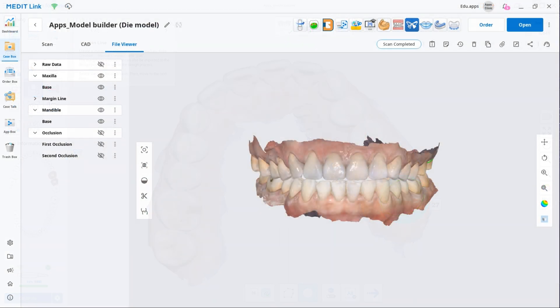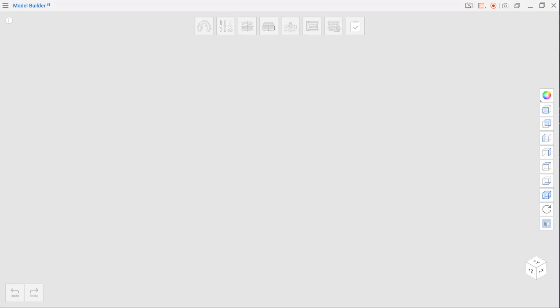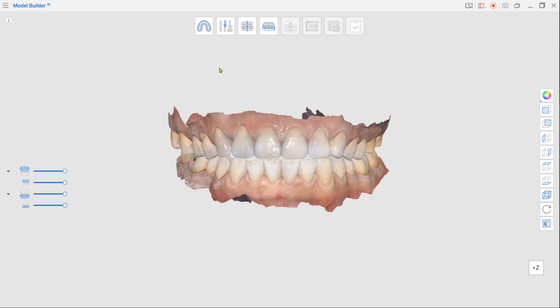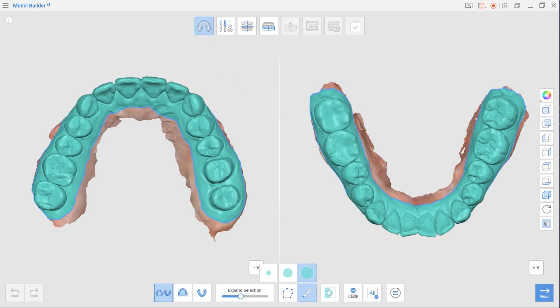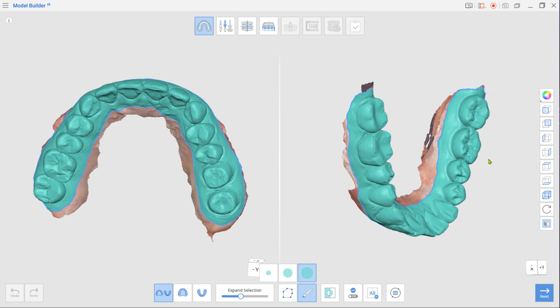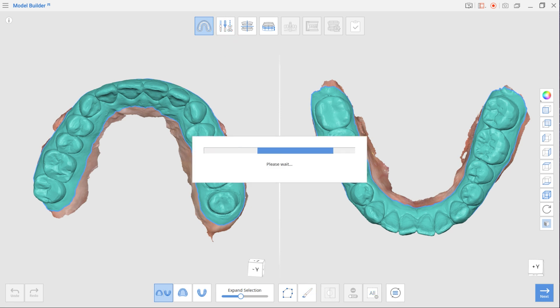After scanning, open Model Builder by clicking the app icon at the top. Your scan data will be automatically assigned as Maxilla and Mandible. First is Area Designation mode. Enlarge selected areas using the Expand Selection slider. Left-out parts can be selected with brush selection.